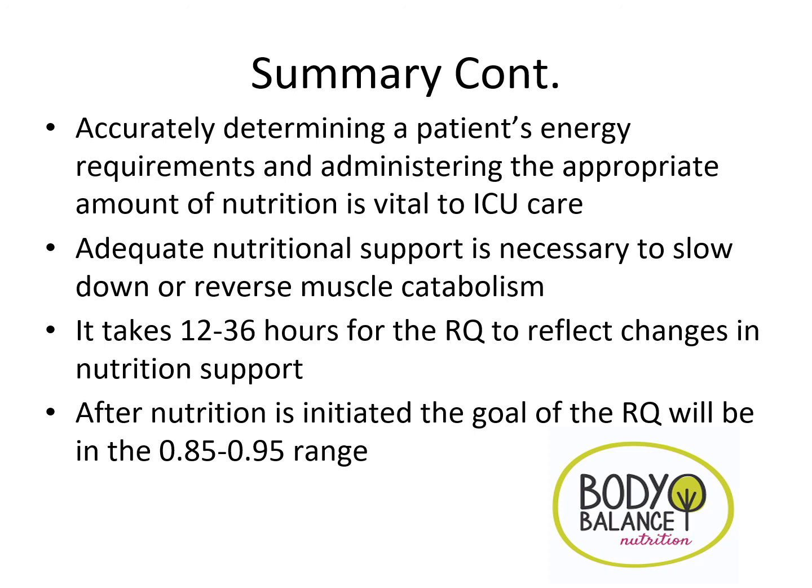It can take up to 12 to 36 hours to really reflect any changes in your RQ after they've made adjustments to nutrition. And again, after nutrition has been initiated, the goal then is to keep that RQ between the 0.85 and 0.95 range.